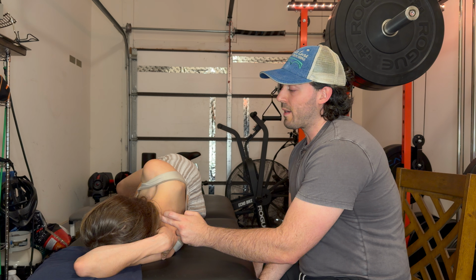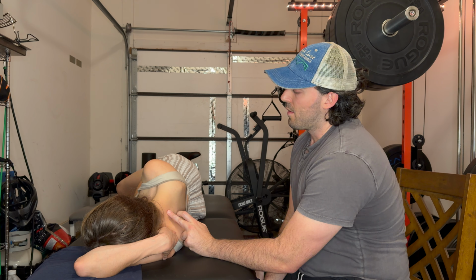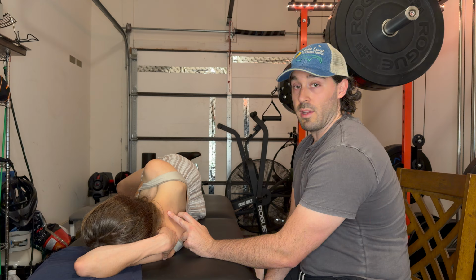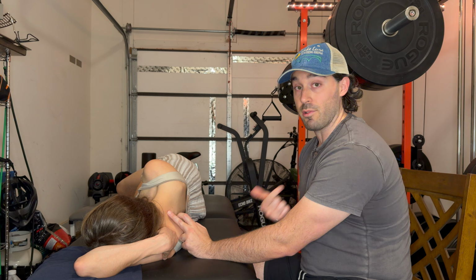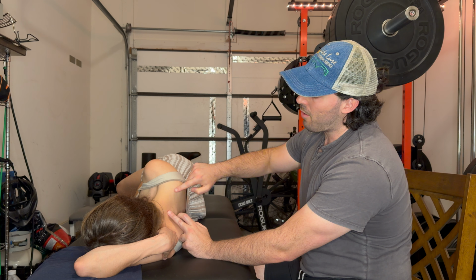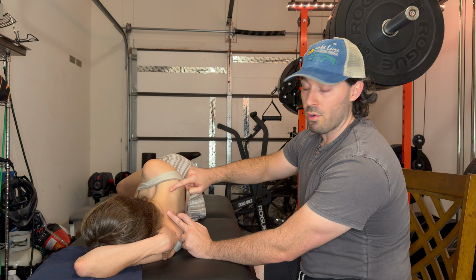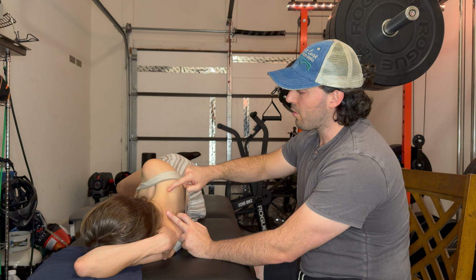We're going to walk all the way down to the level of C5 and C6, which is here. At the level of C6, I'm going to use my thumb as a placeholder in this scenario. This is how we can really palpate the levator scapula muscle. Another thing that we want to make sure we palpate is the superior medial border of the scapula. This allows us to know exactly where the muscle is originating from.